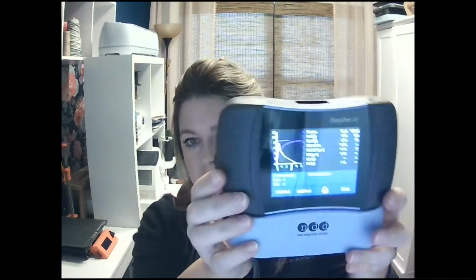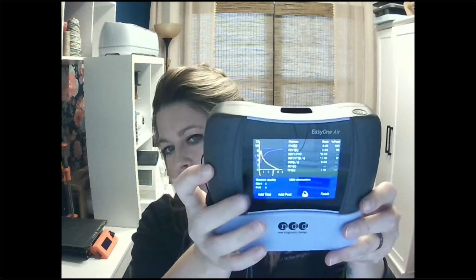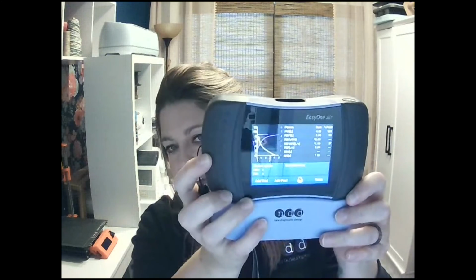And then we would take it to the dock that is connected to our printer. Once that is docked, I'm trying to get it to where the angle is right. All we would need to do is to click that print icon, and it would print our report per our preferences that we selected in the device. It would print directly from the EasyOne Air. All right, and then you would be done.